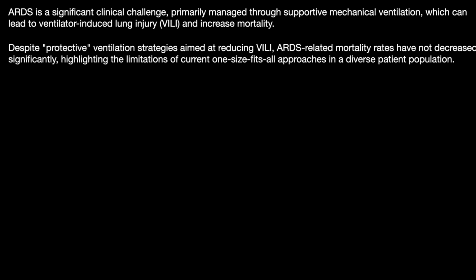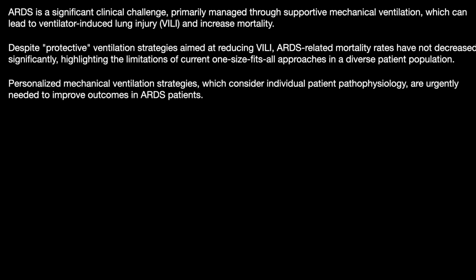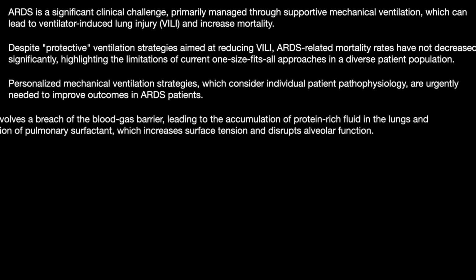ARDS is a significant clinical challenge primarily managed through supportive mechanical ventilation, which can lead to VILI and increased mortality. Despite protective ventilation strategies aimed at reducing VILI, ARDS-related mortality rates have not decreased. This highlights the limitation of the current one-size-fits-all approach in a diverse patient population. Personalized mechanical ventilation strategies which consider individual patient pathophysiology are urgently needed to improve outcomes.